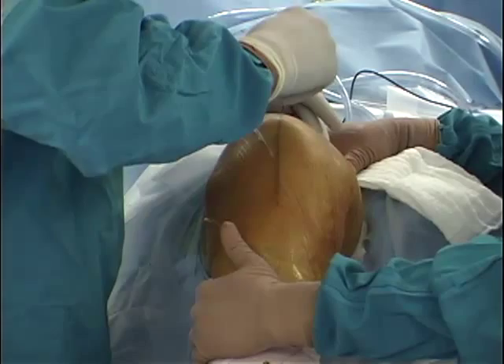A standard anterior midline incision is performed, carrying down through the skin and subcutaneous tissue to the level of the patellar retinaculum.